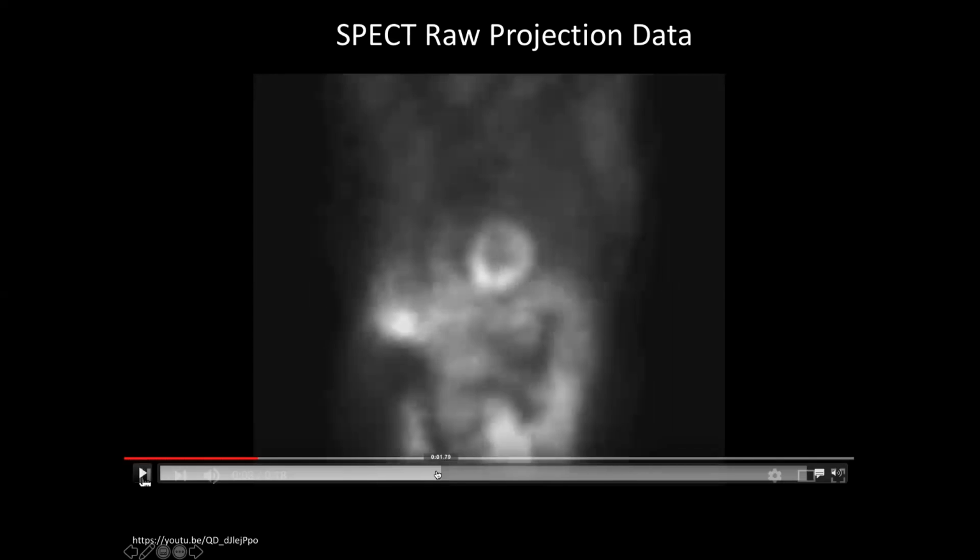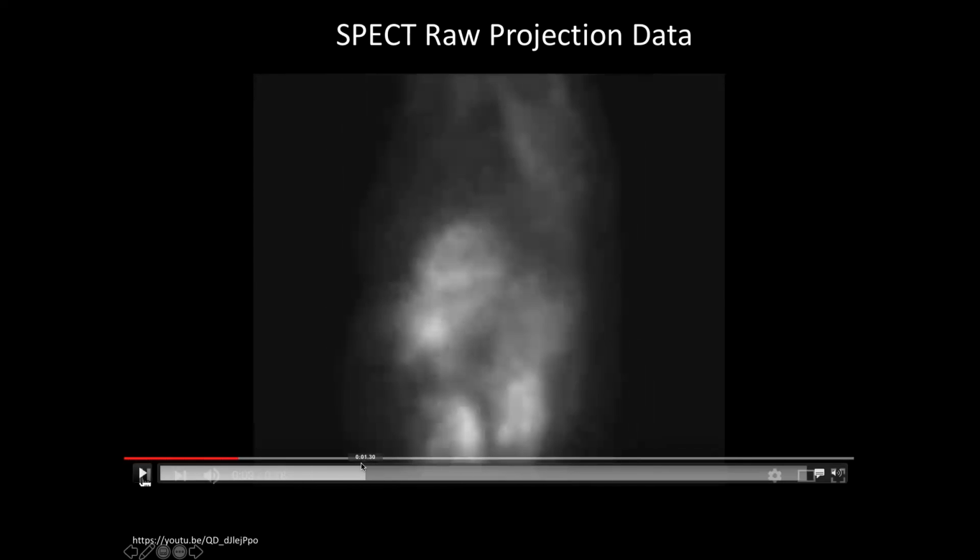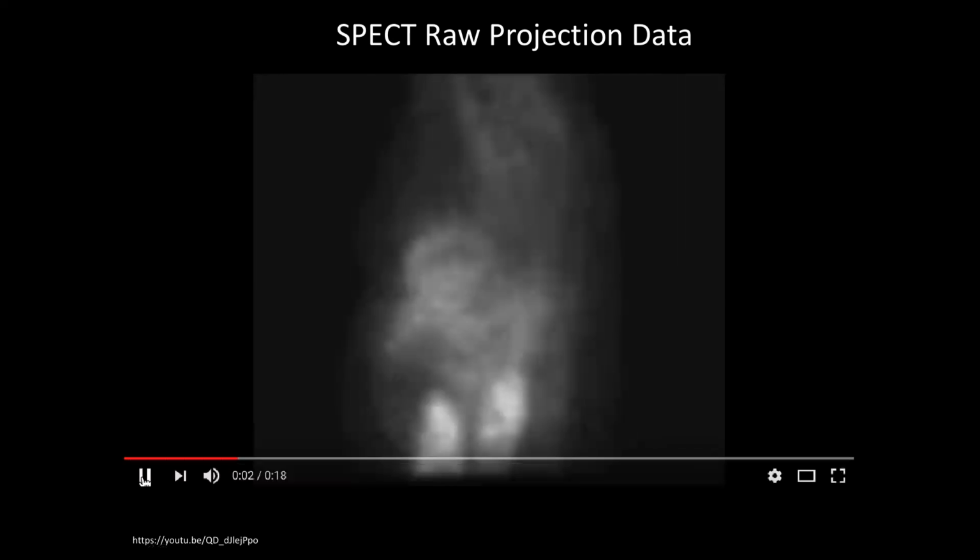And then what we're doing here is showing, after I move my detector to a different view angle, what that profile changes to. So here, my detector would be looking straight at the patient. But say the patient's lying on this table with their head here. The detector comes down, I'm looking straight through their left arm, off this way.